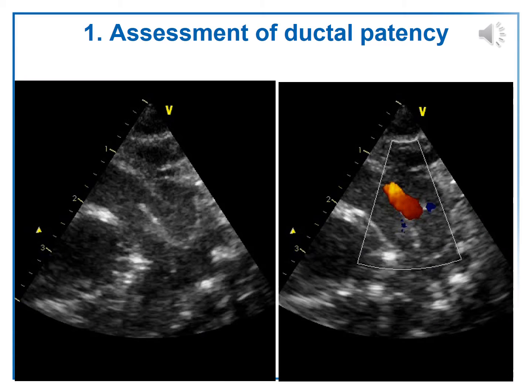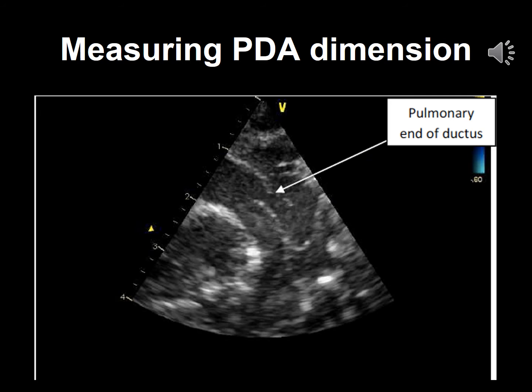Here, the 2D image and a color flow Doppler image are shown side by side, demonstrating the pulmonary end of the ductus arteriosus and a part of the descending aorta, showing the entire length of the PDA. It can be compared with the left pulmonary artery, which is on its right. This slide shows a 2D image of the patent ductus arteriosus and the left pulmonary artery side by side.